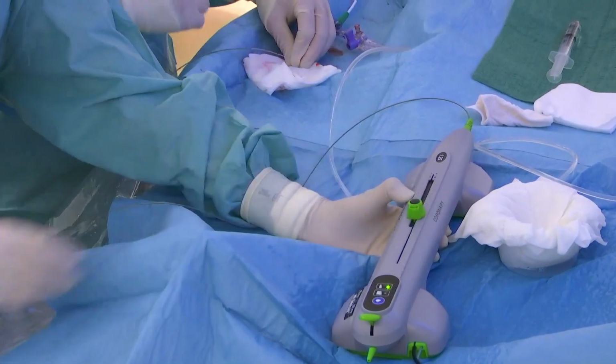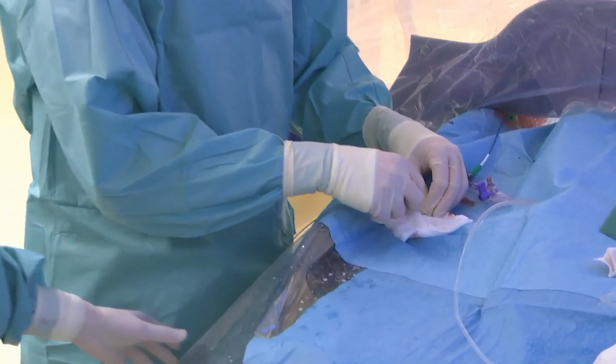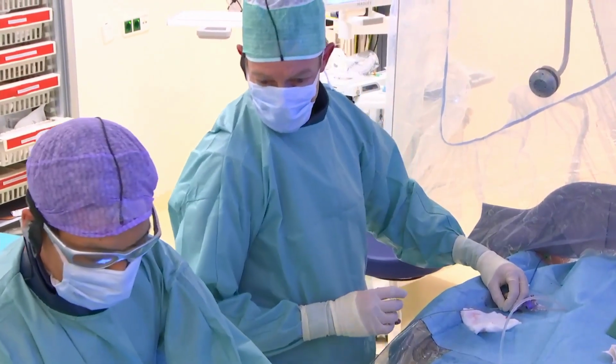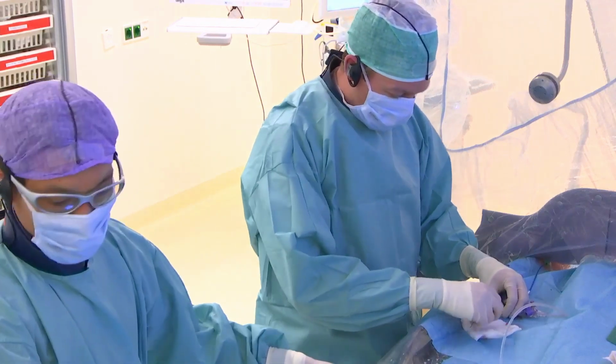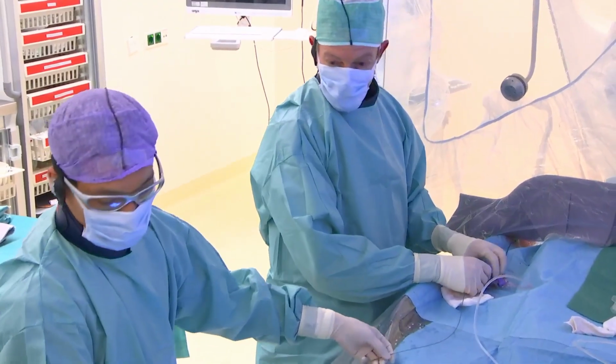Okay, so that's more or less it. You load it on the wire and do the testing on the wire. With the Rota, we were used to doing the testing in a small bucket of water, but here you can just test it on the wire. So the brake is off, glide assist is on, and we go in very gently. Yeah, straight line. Stop.